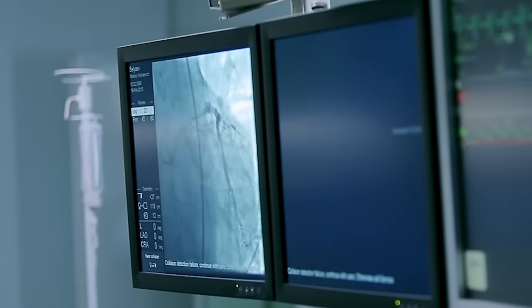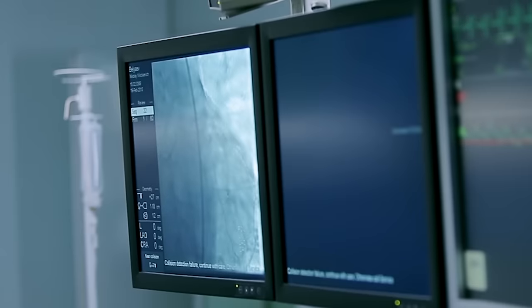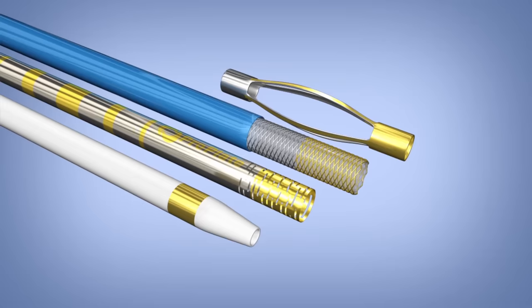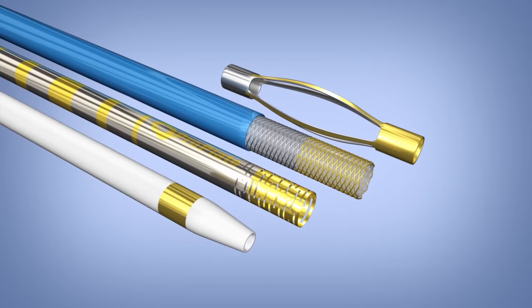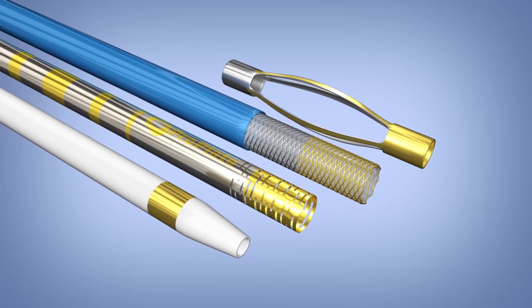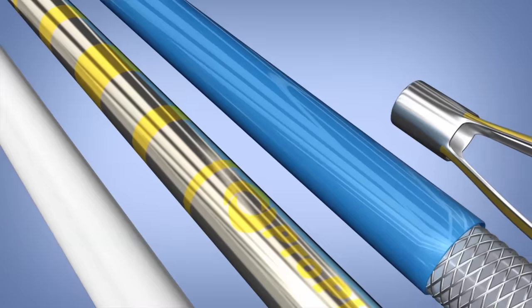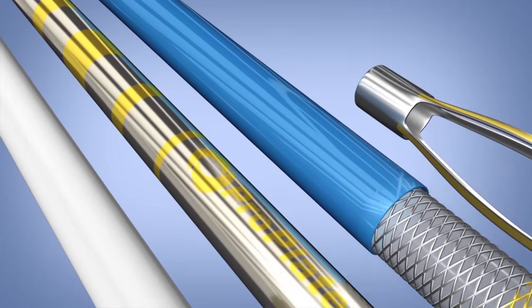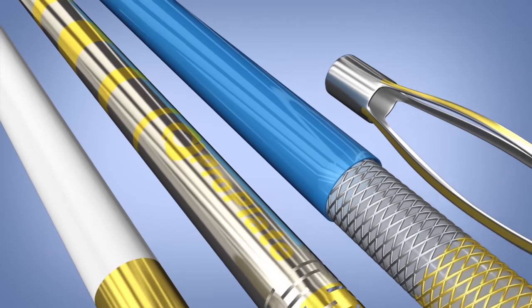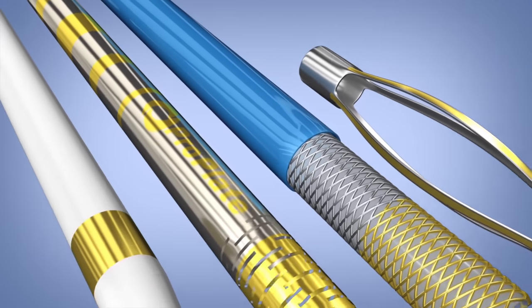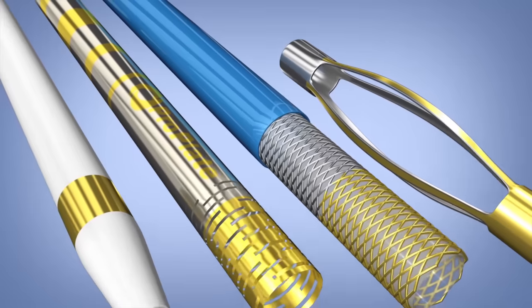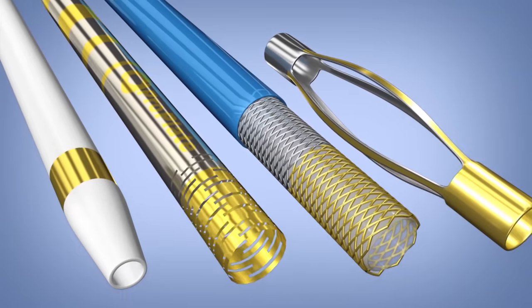The highly radiopaque and biocompatible metal coating is selectively applied to any section of the desired medical device, with endless options for shape, brightness, and design customization depending on the application.